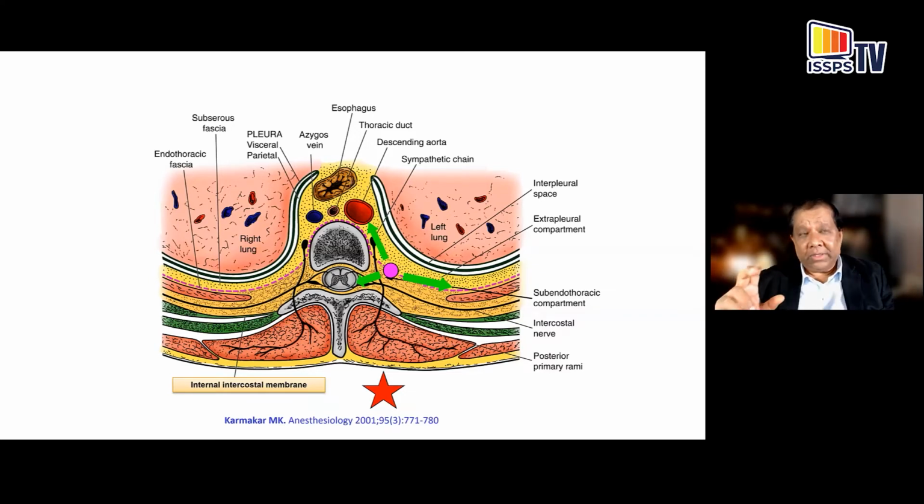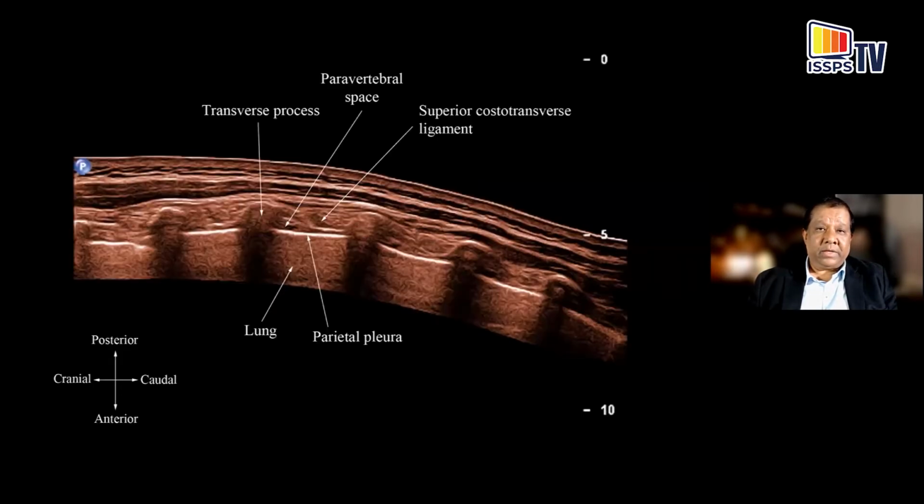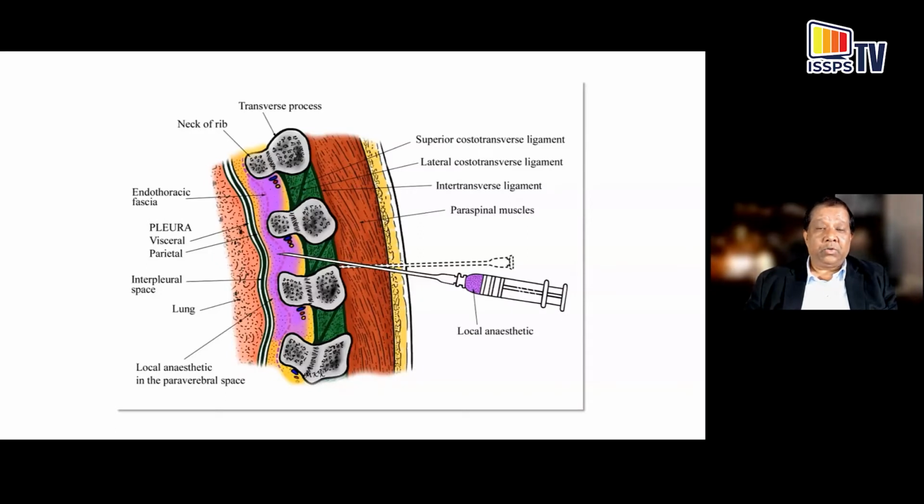However, it is important to understand that the epidural spread is only a small fraction of the total injectate. It is usually ipsilateral, and it produces ipsilateral anesthesia, and segmental spread of anesthesia is usually greater when there is epidural spread as opposed to when there is no epidural spread. Now, the paravertebral spaces communicate with the contiguous spaces through the paravertebral space. So therefore, local anesthetic injected into one space may spread to the space above and below.